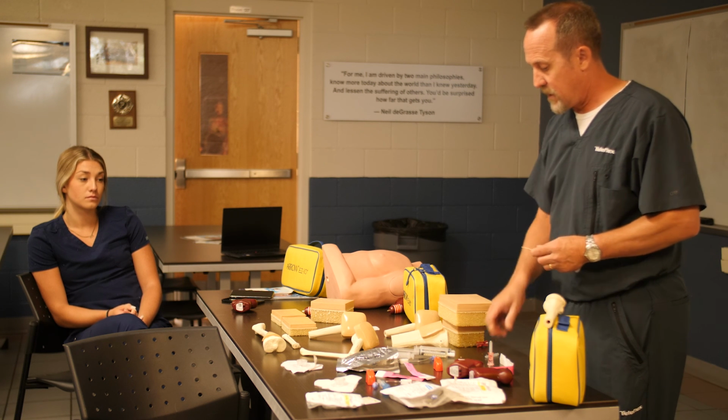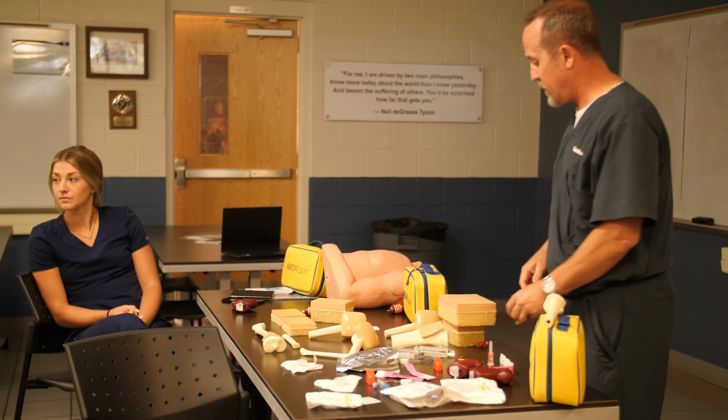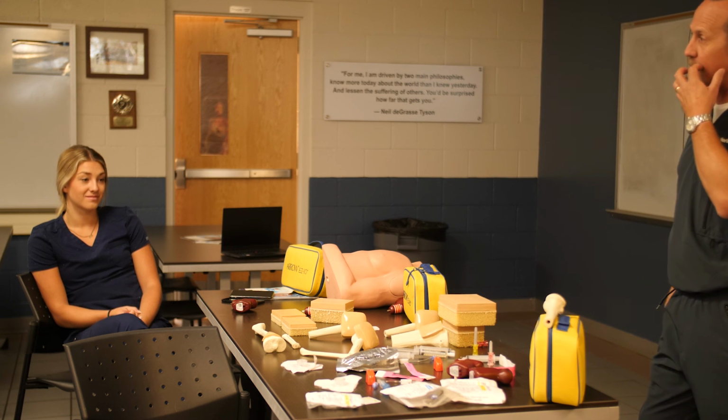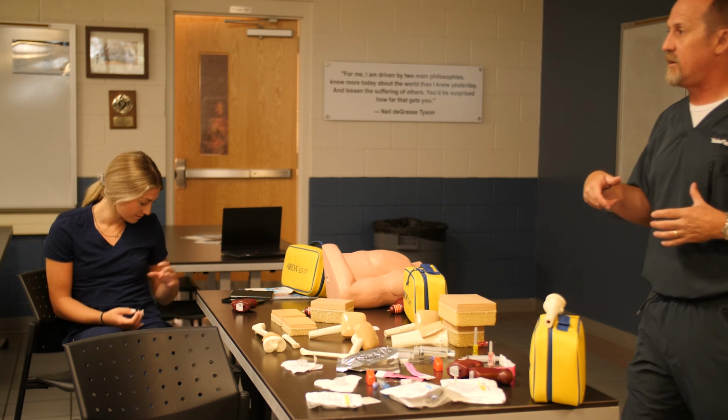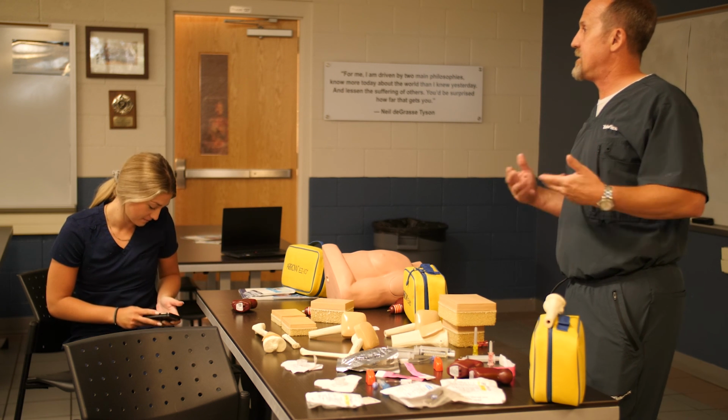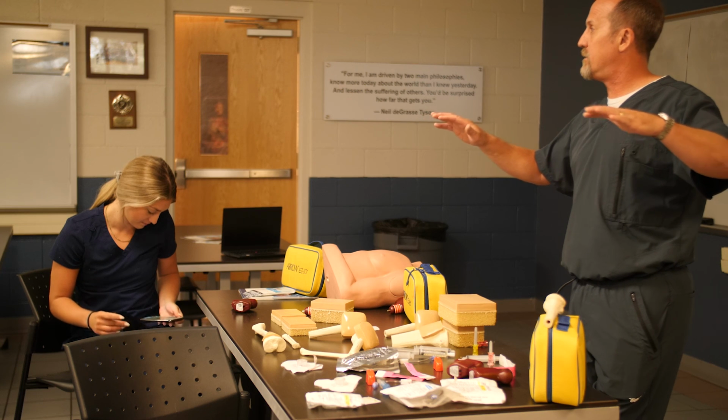All right, well you guys are awesome. So now you're all IO pros. I've got some bone blocks. I've also got some eggs, and I want you guys to come up and get a little hands-on using the needle and driving it in, just so you can sense that tactile feel. I'm sure you guys have all done these before.